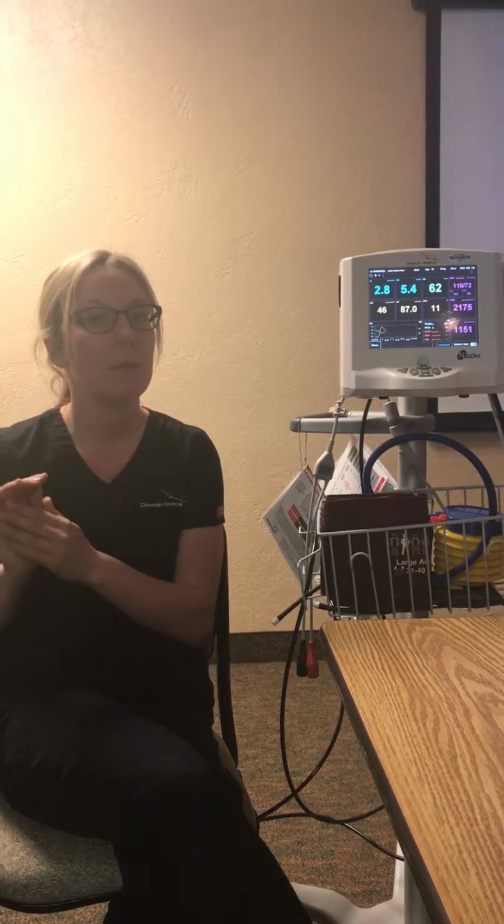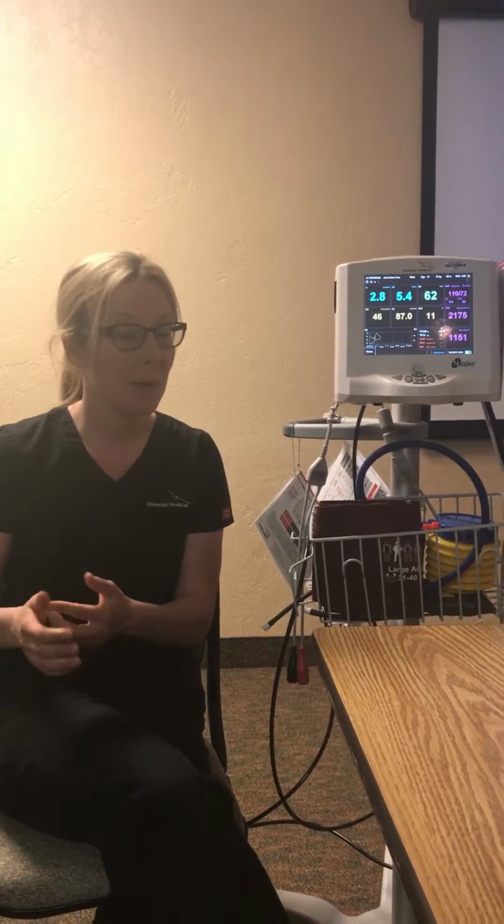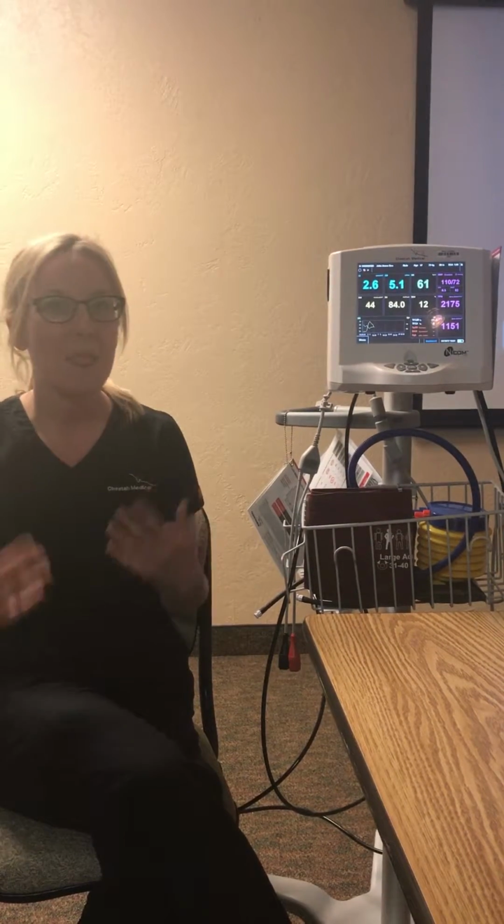The reason is, if you look up the equation for blood pressure, the change of pressure times compliance, or my patient's vascular tone, is going to give you the amount of flow going through the vessel. But that is assuming that compliance, or your patient's vascular tone, is constant or unchanging. This doesn't work because how often is our patient's vascular tone changing? All the time. Therefore, we cannot say pressure equals perfusion.